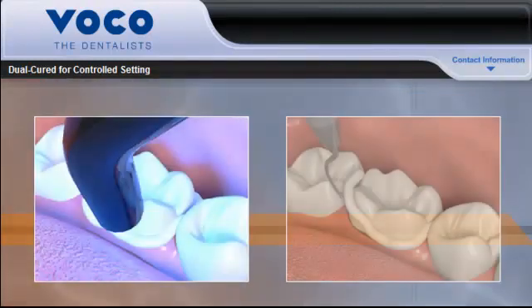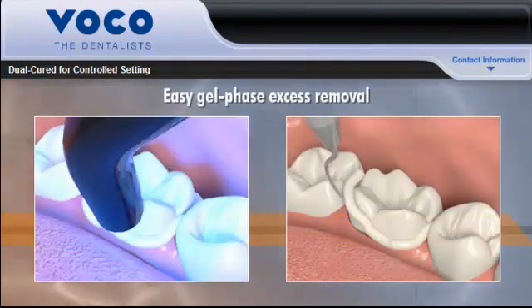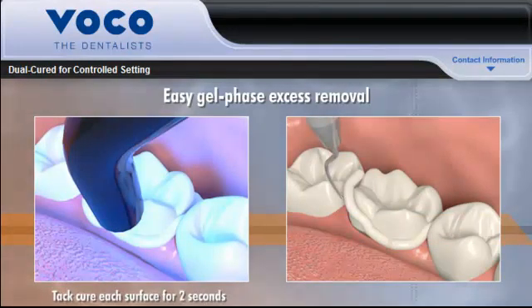Bifix SE also offers easy gel phase excess removal. Simply tack-cure each surface for 2 seconds and then remove any excess material.